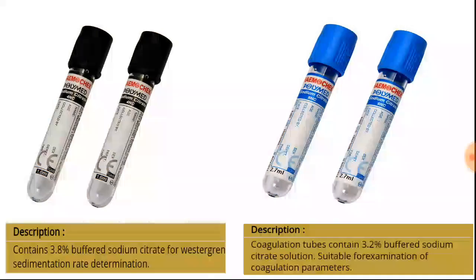Here two types of vial are shown in the slide. At the left side is the black top vial. It is the ESR vial, containing 3.8% buffered sodium citrate for Westergren erythrocyte sedimentation rate determination, or ESR determination. At the right is the blue top vial, for prothrombin time. Coagulation tubes contain 3.2% buffered sodium citrate solution, suitable for examination of coagulation parameters, the PT, APTT, etc.